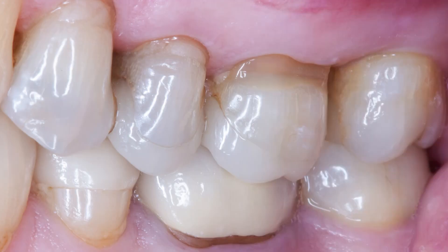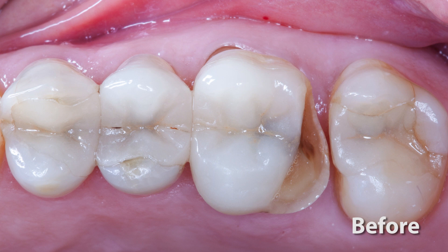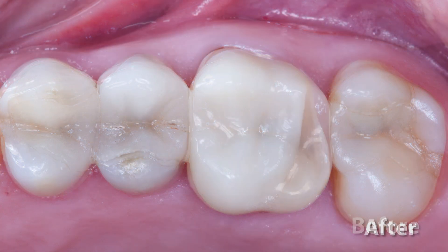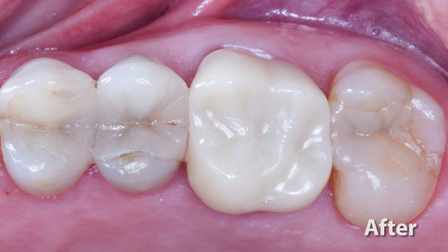For this case, my patient presented with a fractured all-ceramic restoration on his upper left first molar. The plan is to replace the defective restoration with a one-hour Bruxer crown utilizing the innovative Glidewell in-office CAD-CAM solution. In this episode, I'll take you through an overview of what this in-office Bruxer process looks like.